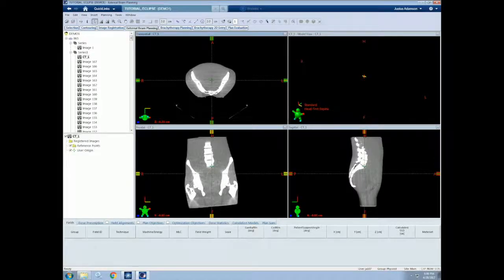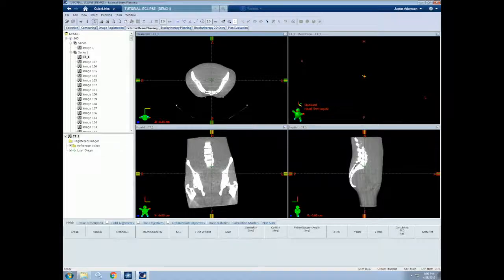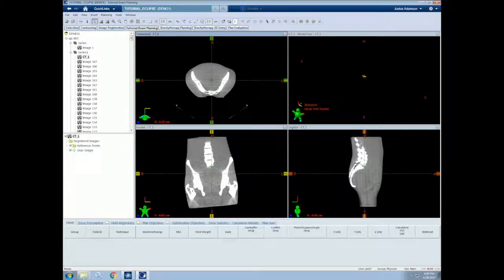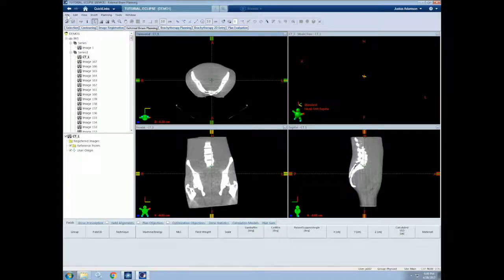You can see all of the images that were loaded on this top left window. Right now the Scout image is open, but let's drag the CT into the viewing plane so that we can look at it. I will now discuss how to import a CT scan to a patient that already exists in the database and that is already currently open. So to do so, we can use the import wizard. So we'll go to File, Import, Wizard.